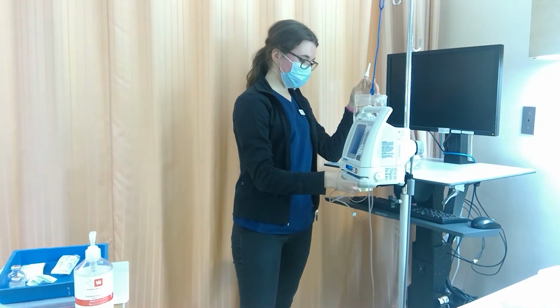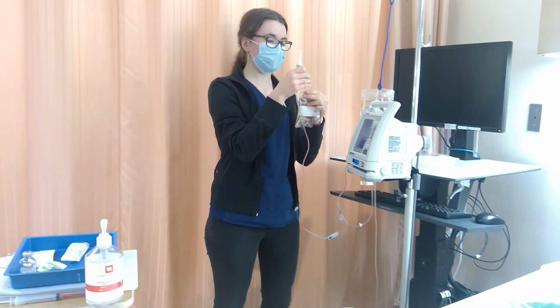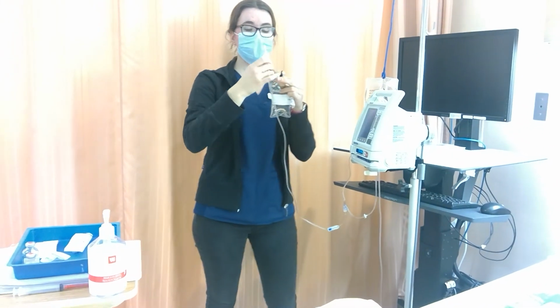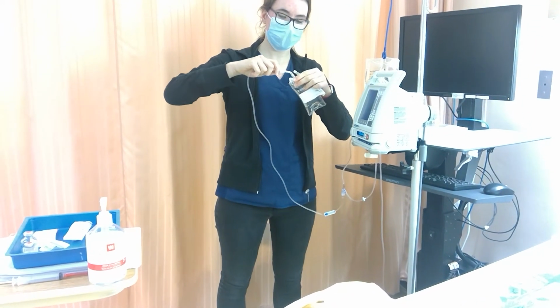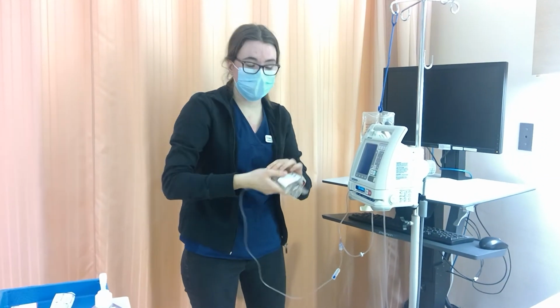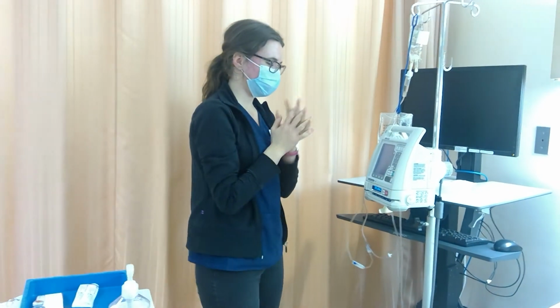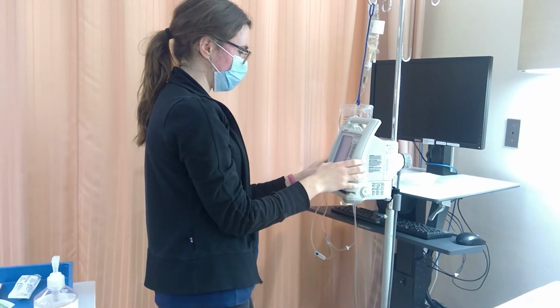So now that we've back primed, we're going to take this and uncap that. And some medication did spill out there, so in practice, if this was a really delicate calculation, we would want to redo that, but in demo, this is very used equipment, so it kind of happens all the time. So I just attached those without contaminating either end, and I'm just going to hang that up here. You always want to make sure to be sterile there. So I'm going to start my secondary.